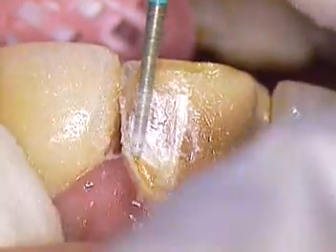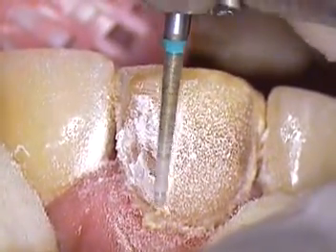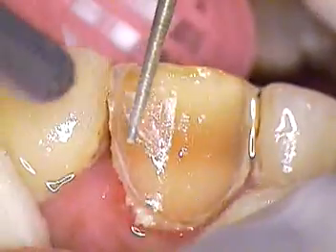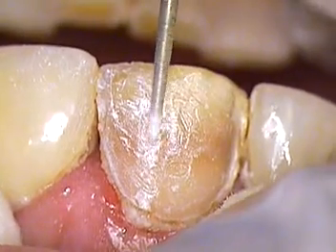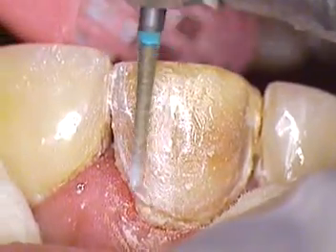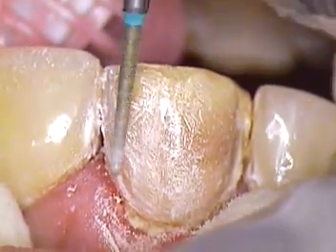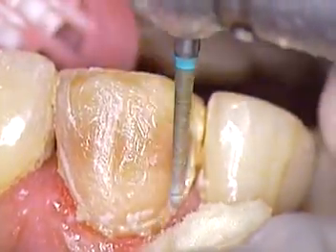So the doctor that took care of Troy's case in the past did prep the tooth, and I'm outlining that now. I'm just removing this, which appears almost like a metal flake. It's not really made of metal, but it's a metal flake reflective veneer cement, which has given him the masking ability. Our goal today is to use a luting cement that will also mask this tooth and give it the optical properties that are necessary.